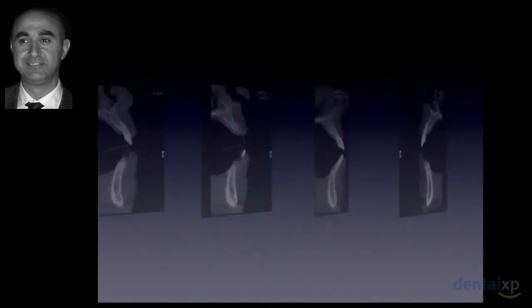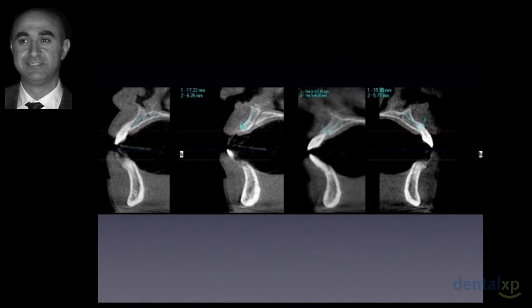If we look at the CT scans, we look at the labiopalatal dimensions of these premaxillas, where the upper left central incisor is. Somehow we have good bone, not enough to place implants without bone, but it can be placed with bone. But when you look at it, if we place the implants in this bony housing, we would actually find that we are placing the implants in the same labial inclination, and thereby we're not really solving anything.